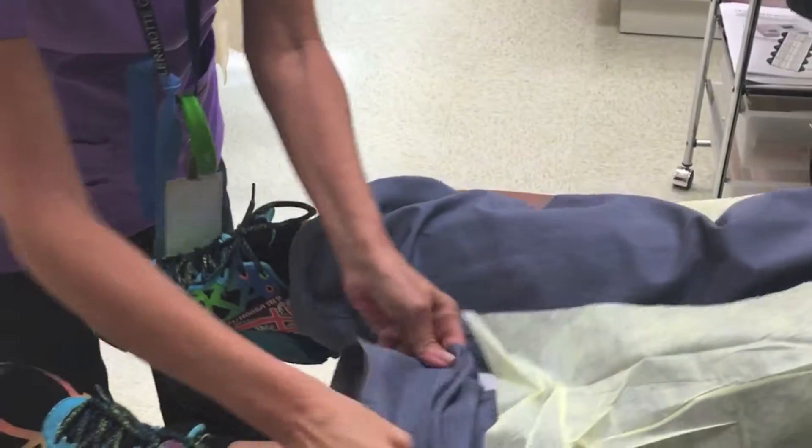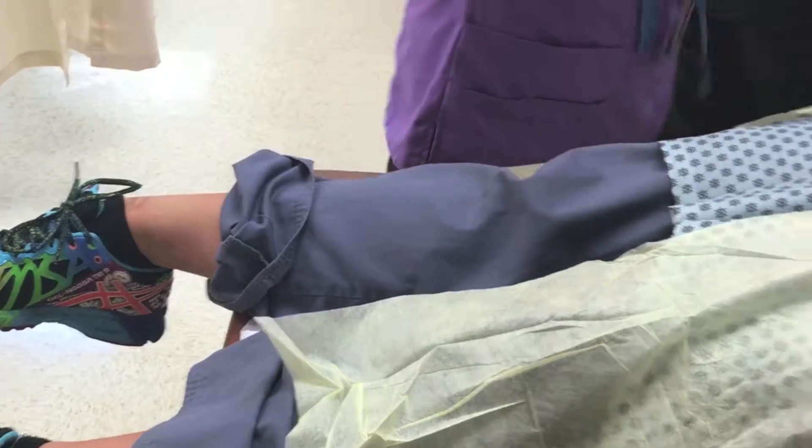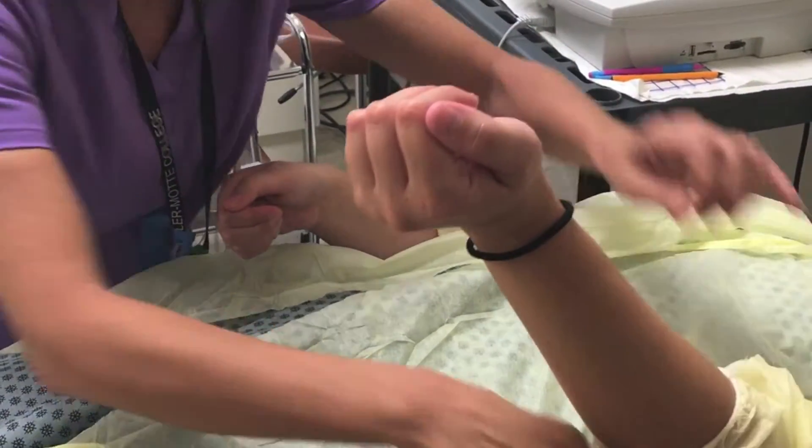I'm just going to need to pull your socks down a little because we have to put some leads on your ankles and on your wrists. So I'm going to pull these back.